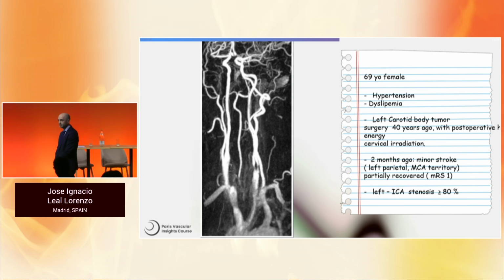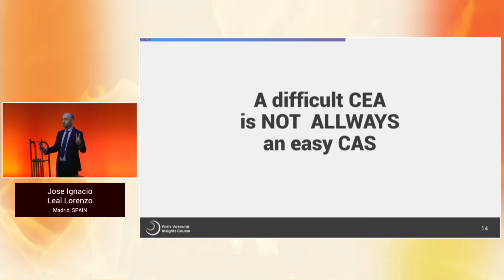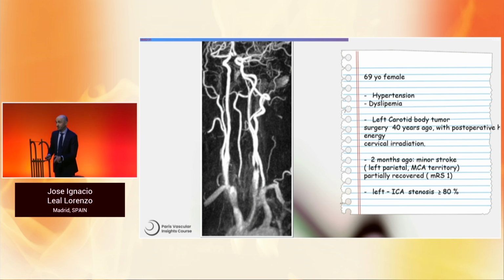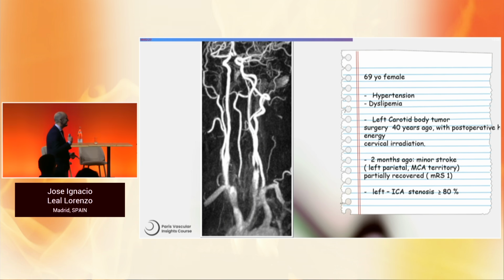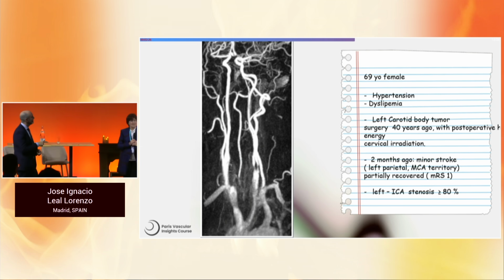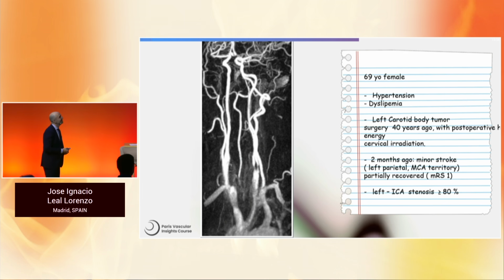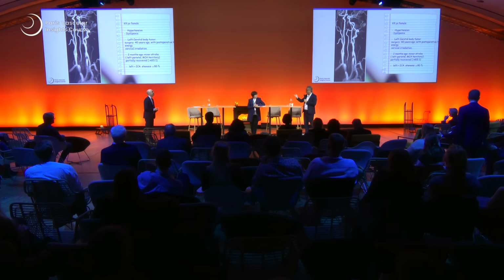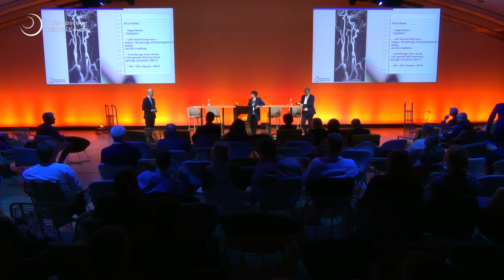Nice one. Before we discuss the case, I would like to make 2 comments, because I know what you're thinking about. Nobody wants to open this neck. Agree? No. Nobody. No, you're wrong. I'm wrong? Also, depending on the quality of the skin and the sub-skin, there's also missing the imaging of the neck of the patient. It's something we should evaluate with ultrasound.